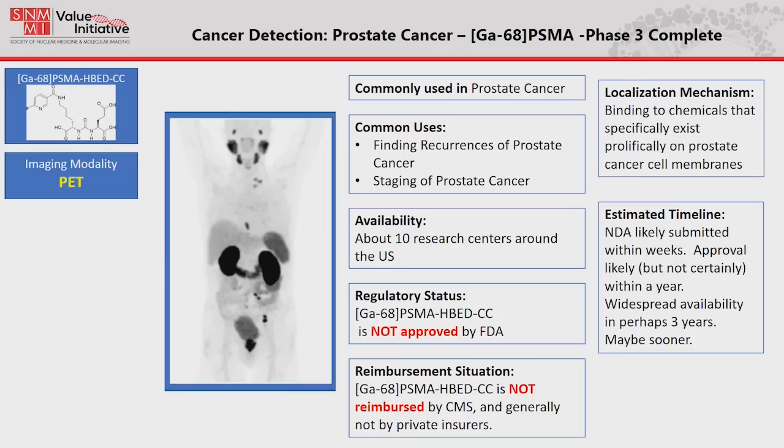Here's some not FDA approved but coming. This is another exciting prostate cancer agent, gallium-68 PSMA. There's a lot of excitement over this. The choline is good, the axumin is good, but the PSMA seems to be able to detect much smaller lymph nodes sooner.